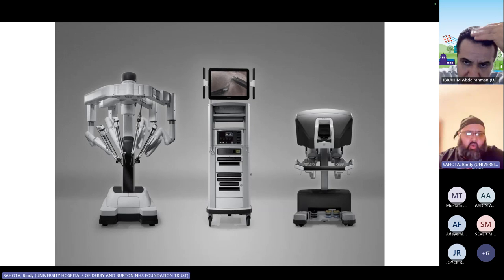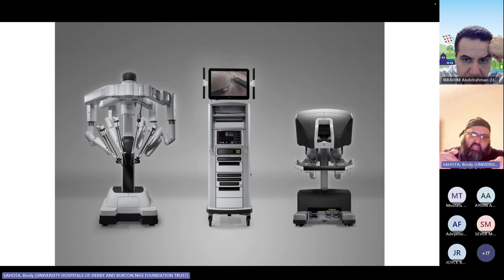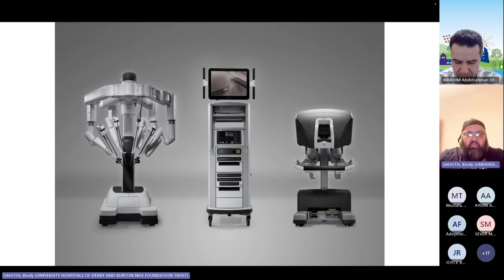On the left of the image, you've got the actual Da Vinci robot itself. In the middle you've got the cart, which is where all the equipment gets plugged in. And on the right, you've got the surgeon console, which is where you actually do the robotics. The thing about robotics is it's all about wristed elements of surgery as you rotate. It's not like laparoscopic surgery where you're working on a big parallax like this. I'm sure you've all done some endoscopic stuff, and you've done a general surgery rotation and played with a laparoscope. But robotics is all about fine incremental movements, turning at the wrist to give you that angle of movement, and it's not big clamping movements across.